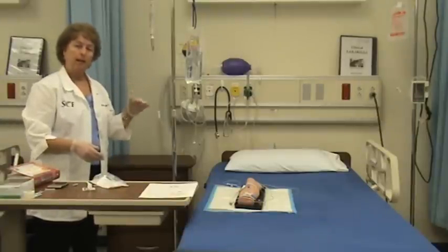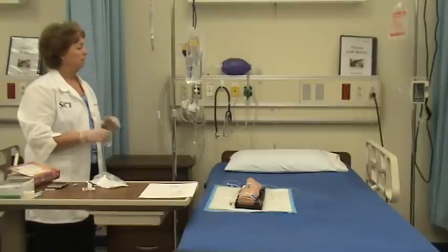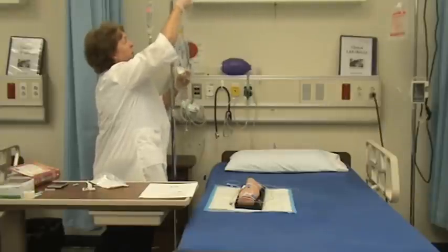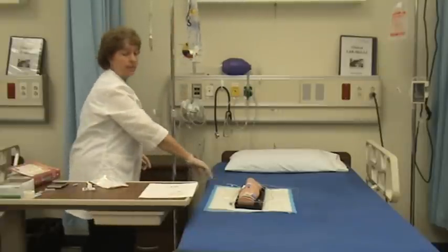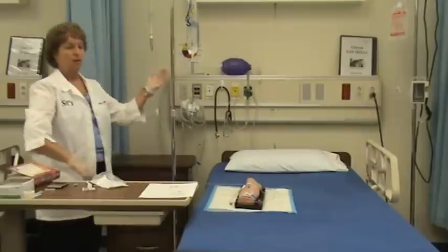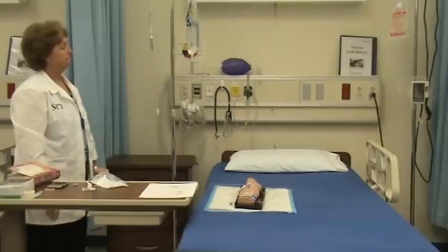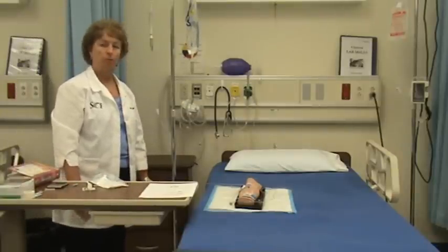Once a half hour has gone by I come in, assess that the secondary IV is empty, and close it. Then I raise my primary bag and reset the rate to the primary setting. For example, if this is running at 100 milliliters per hour, I'll set it back to 16 drops per minute from the 33 drops per minute it was running at. This concludes administering IV piggyback medication through a running IV.